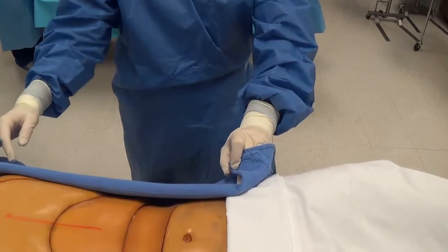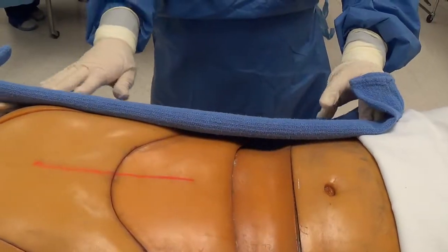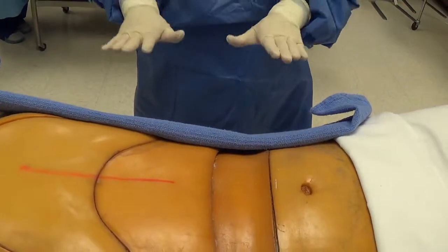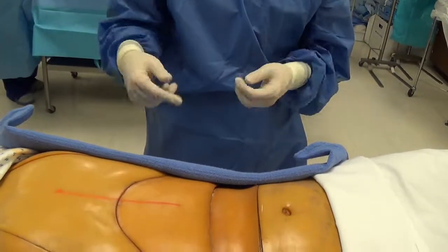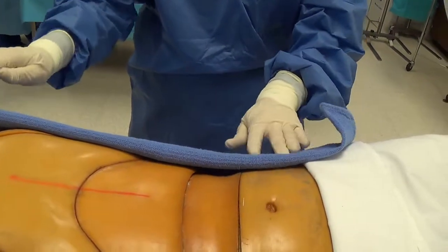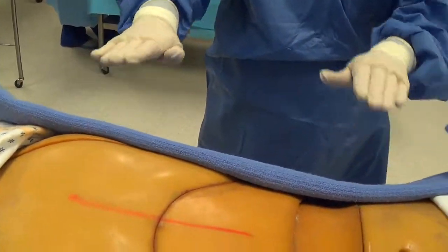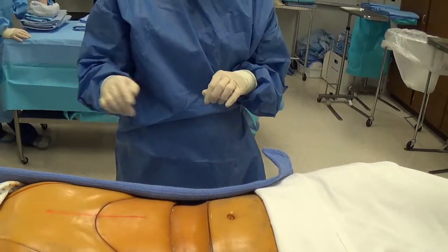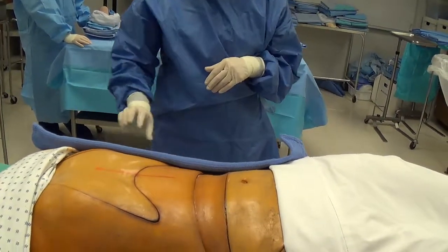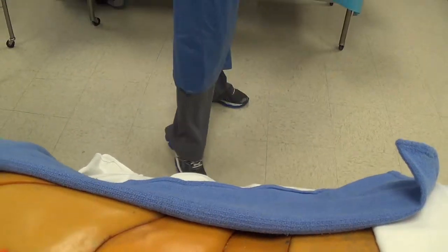The area we're squaring off is about the size of the fenestration on the drape we'll be placing. Remember, if you place your towel too far out you can back it up, but you cannot bring it closer to the incision site. Resist the urge to open the towels up because you'll get too close to unsterile areas. Just place the towel and back your hands up without coming too close, and watch the front of your gown near unsterile areas and the exposed linen.